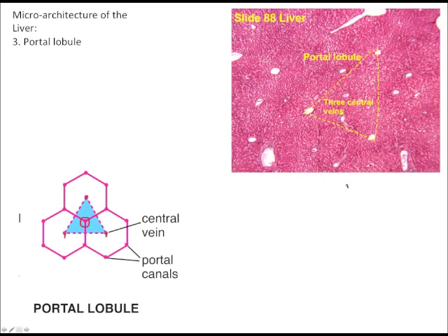This organization is describing the exocrine function of the liver, which is the production of bile into a bile duct system that then exits the liver. So we see the production of bile by hepatocytes, increasing thickness and amount of our duct system as we lead to the portal canal.